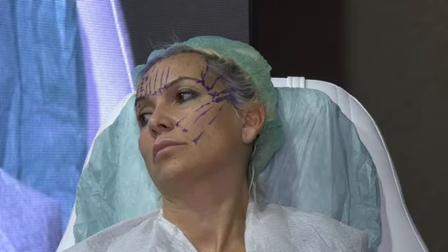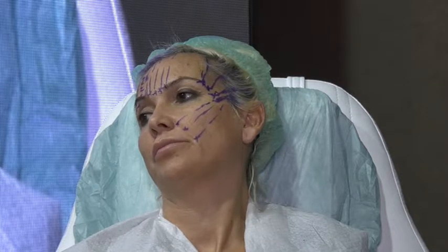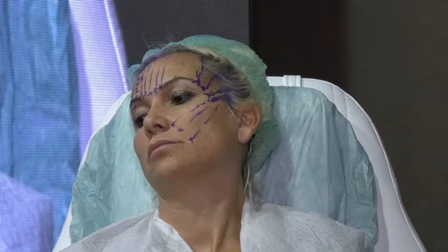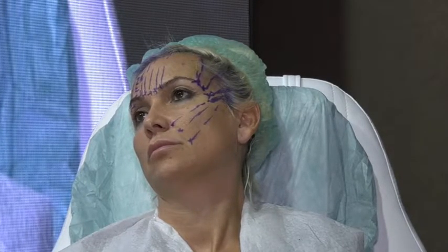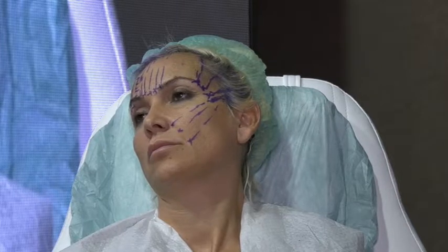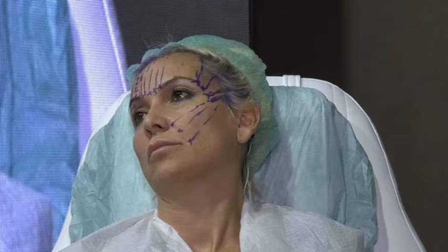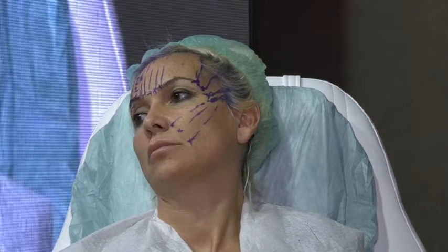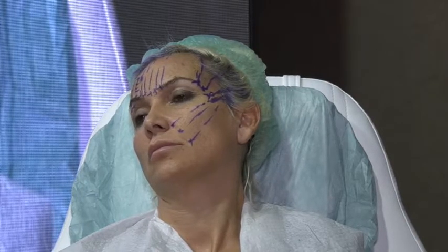Almost started from up and like the vector direction. Yeah, it is a vector, but the issue is I cannot have one vector of lift with 2 different zones. Otherwise, the face will not have a shape. It will be like a balloon. I want to create shape. If you want to create shape, you have to define the face. You have to differentiate the zones from each other. I have to make demarcation between one zone and the other.